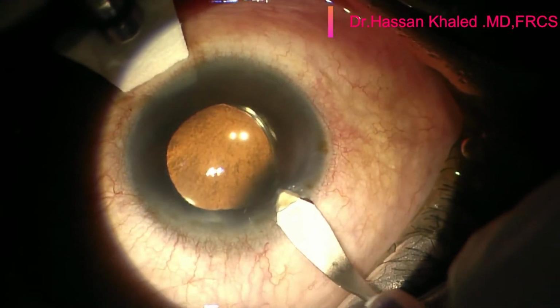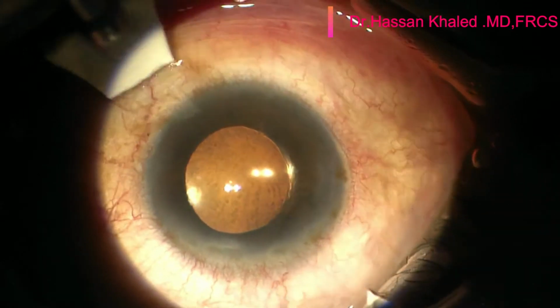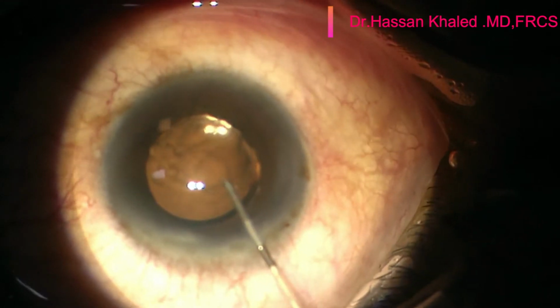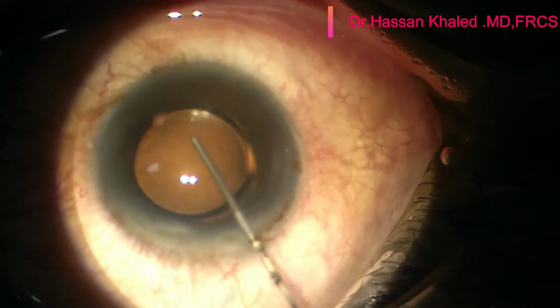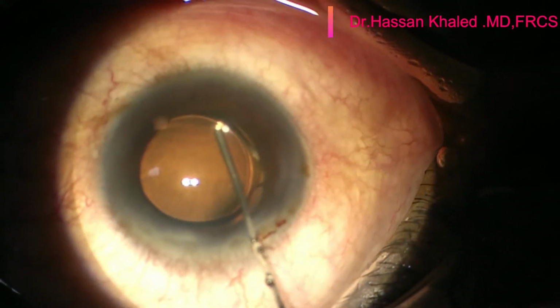Phaco and IOL was done first for the left eye, and the patient was happy with the result, and she was insisting to change the IOL in her right eye. Here the surgery started with a 2.2 millimeter clear corneal incision.